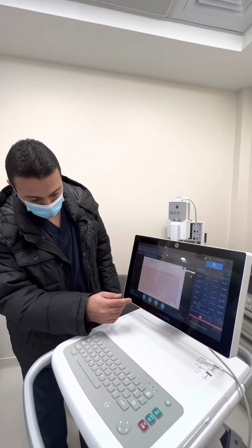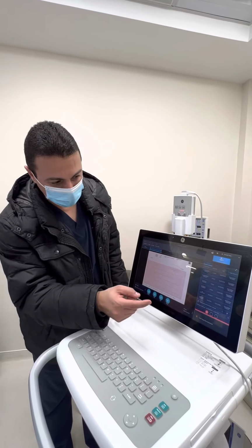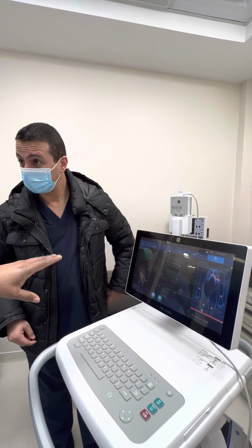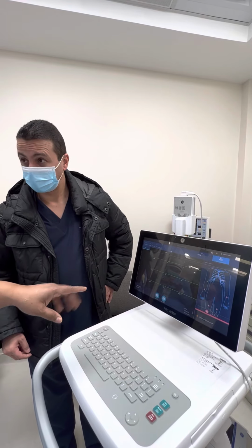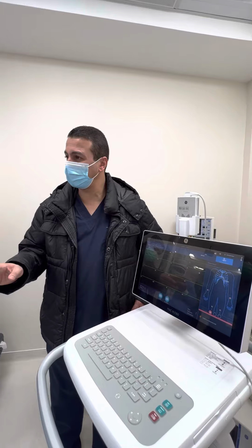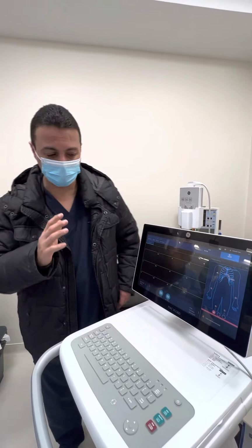What else did we do in the software part? Let me get out of this one. This edit will help us to check in case we made any mistake in the identification of the patient, we can fix it through the edit. Yes. But there are no mistakes actually, because as soon as you place an order, everything will come from the system. Yeah, from the ECG.